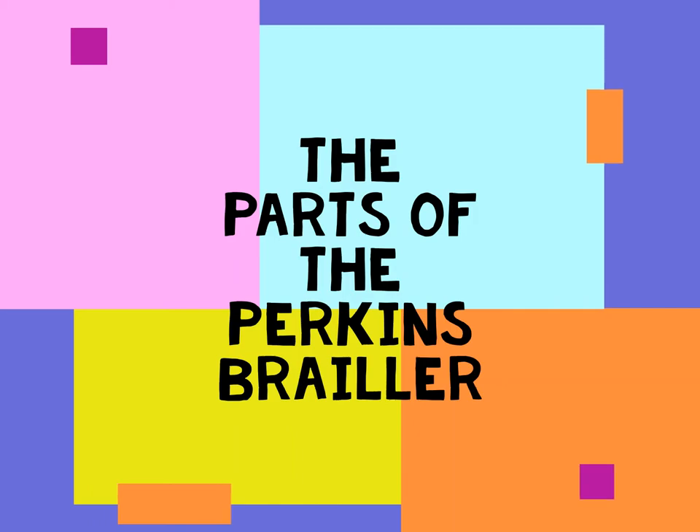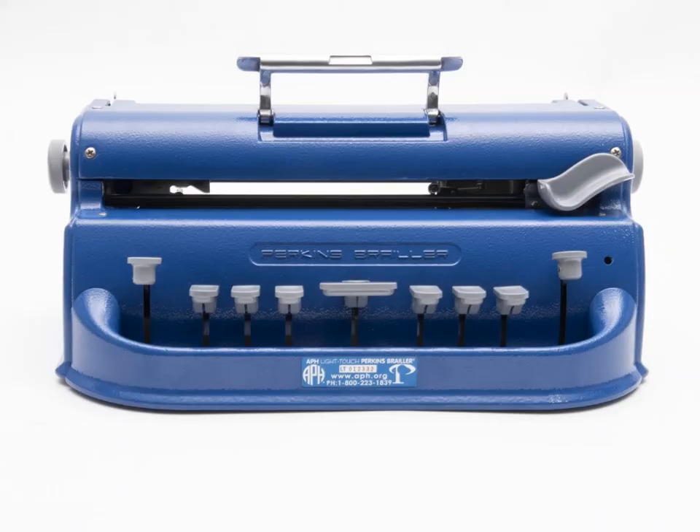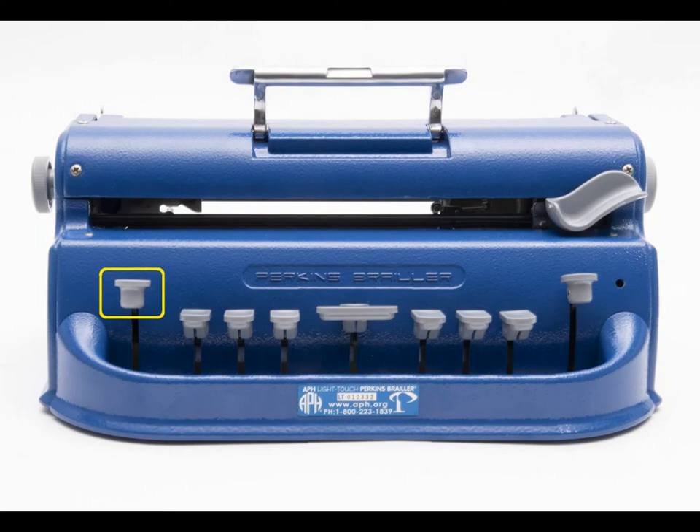This video is going to go over all of the parts of the Perkins LightTouch Brailler. The first key on the front face of the Brailler is the line spacing key. This works the same as the enter key on a laptop, as its job is to move one whole line down each time it is pressed.